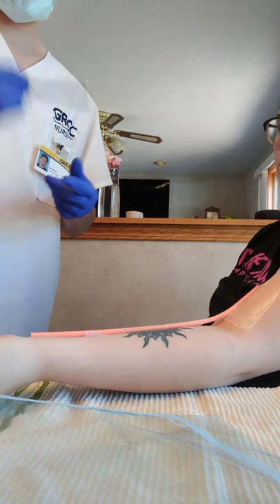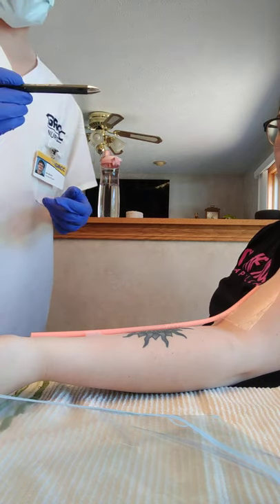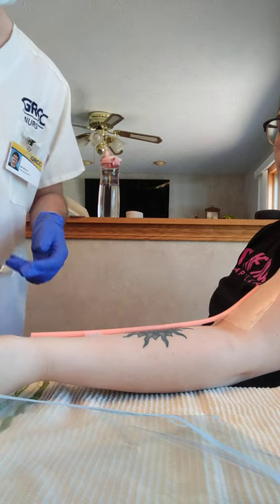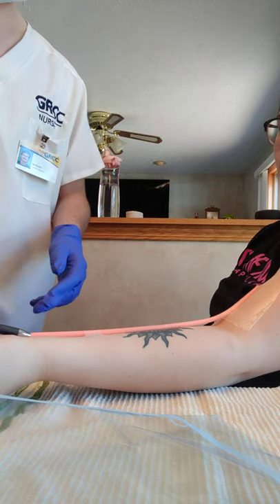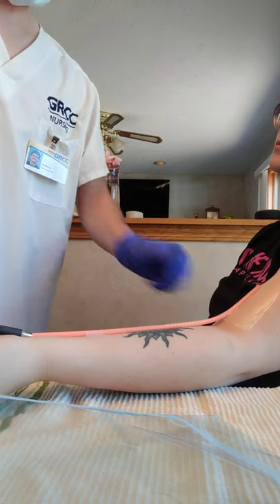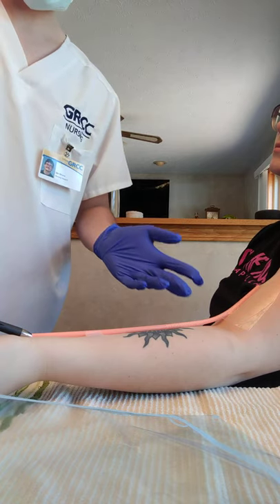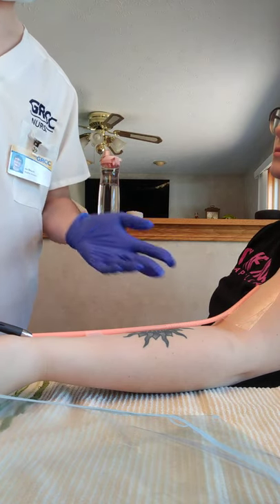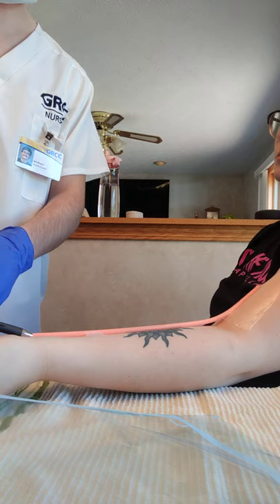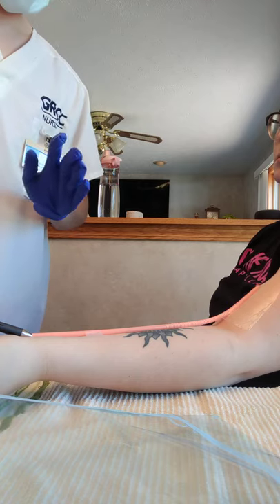And next, this pen will simulate my syringe of normal saline solution. I am going to hook up the syringe to the end of the needleless port, and then I'm going to unclamp the catheter. Next, I'm going to slowly aspirate until I can see blood fill into the tubing. So I'm going to aspirate now.